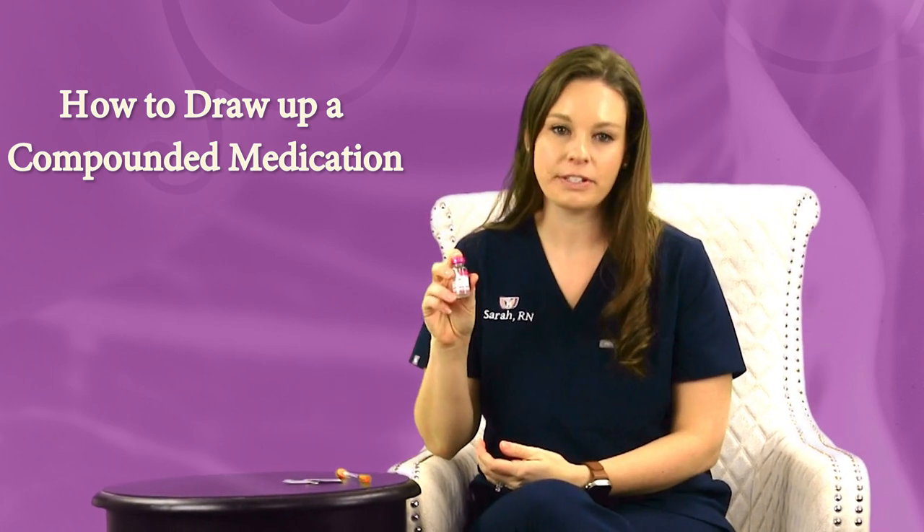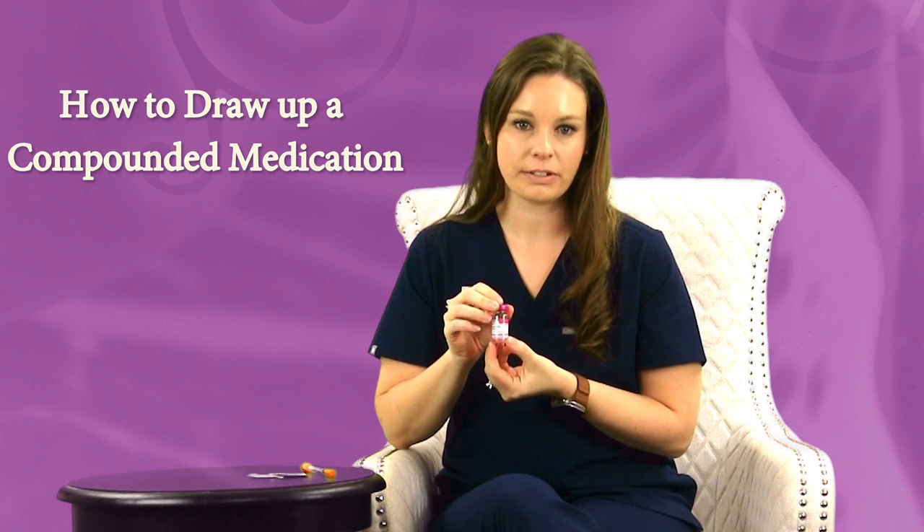So I have a semaglutide here. What you're going to get in the mail are three vials of semaglutide. You'll also get enough insulin syringes to last and alcohol swabs.